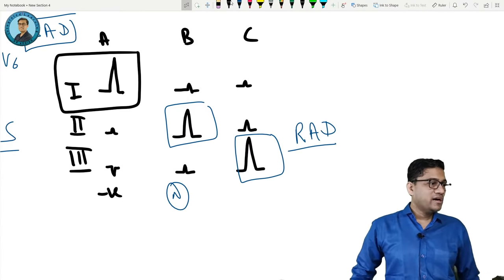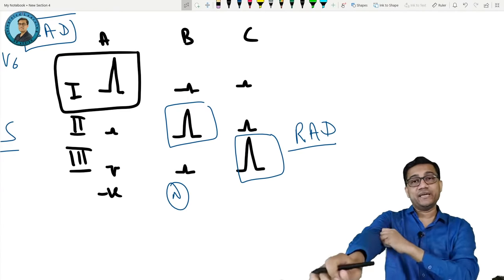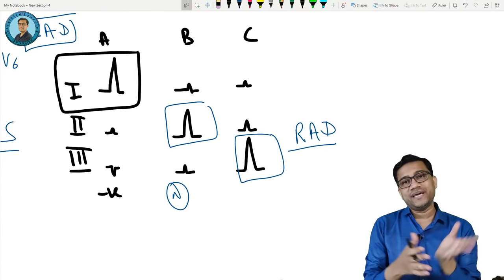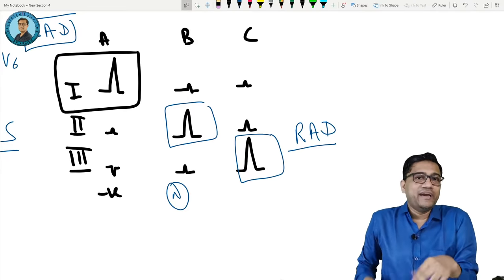Now comes the important thing: the calculation of blocks and tachyarrhythmia. Then I'll finish the class.